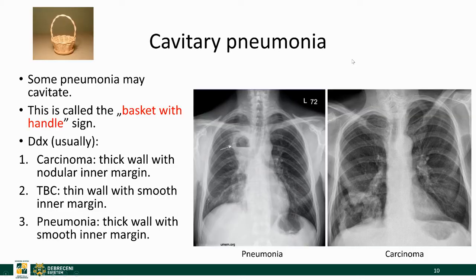Some pneumonias might cavitate, and if we see a cavity, this is called the basket with the handle sign — the full basket has a handle on top and fluid contents below, so due to the fluid and air within the cavity, you see a horizontal interface between them. Several other diseases also cause cavities, such as carcinomas. Here is a large cavity in the lower third of the right lung, but the wall appears nodular and thick, which is typical for carcinomas. Pneumonias have a thick wall with a smooth inner margin, while TB would have a thin wall with smooth inner margins.